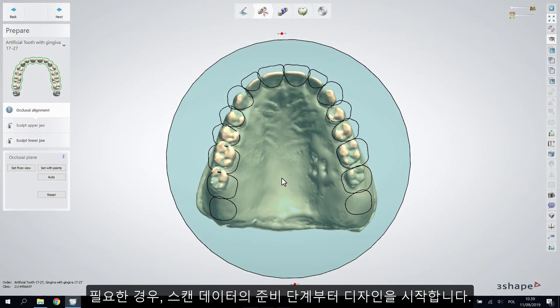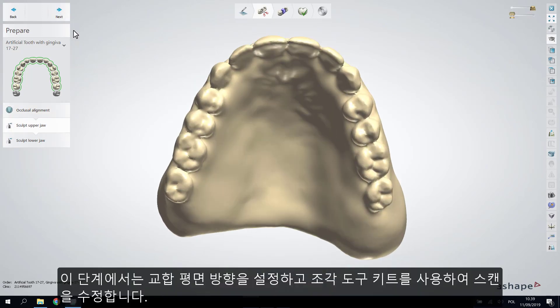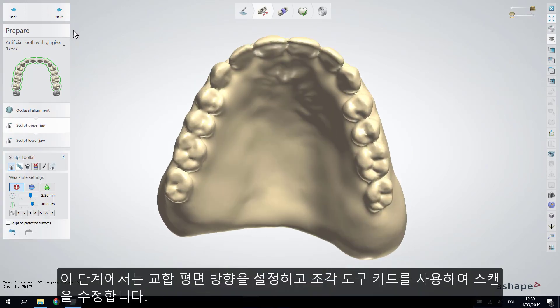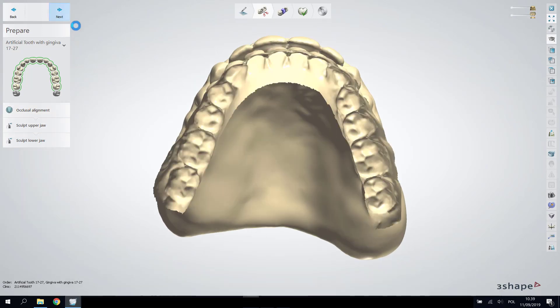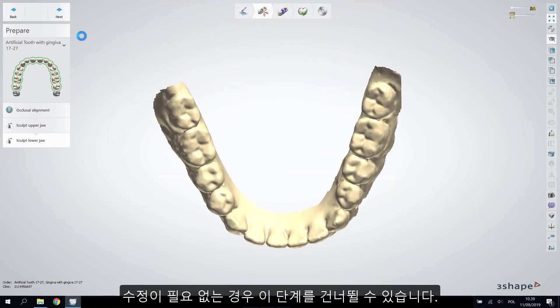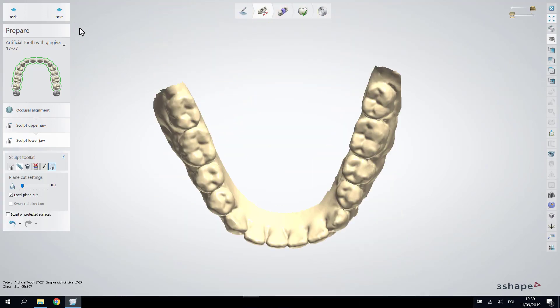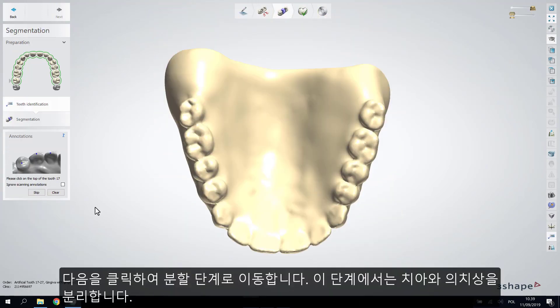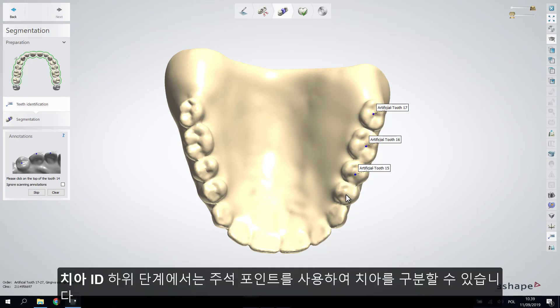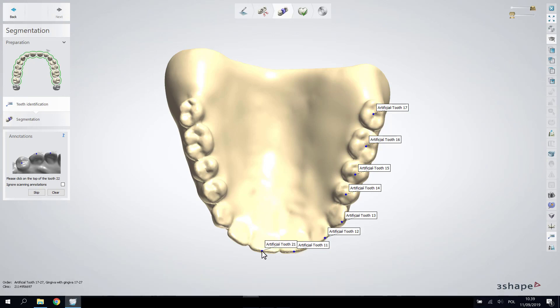Start by preparing the scans. If needed, orient the occlusal plane and adjust the jaws with the Sculpt Toolkit; otherwise, you can skip this step. Click Next to move to the segmentation step, which helps you separate the teeth and the denture base.